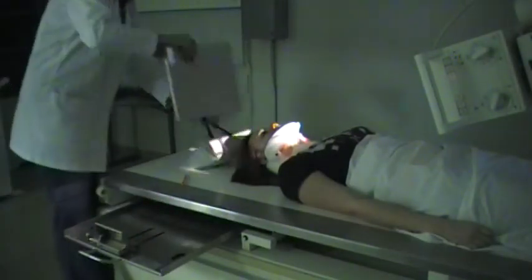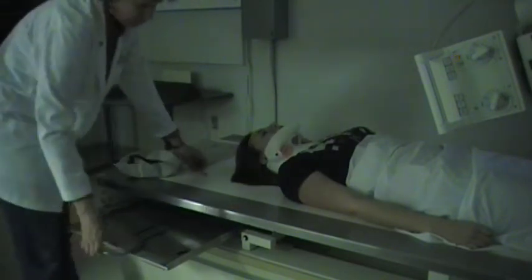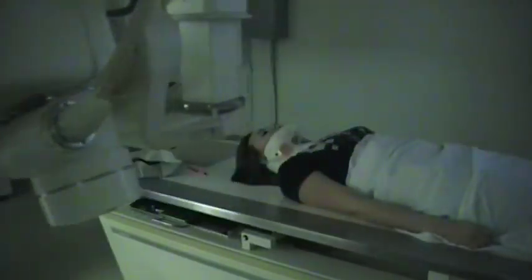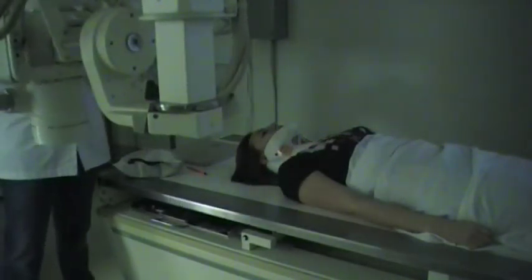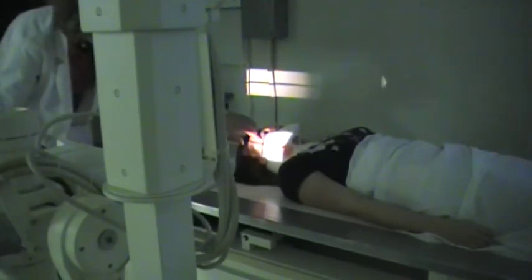Last, I'm going to do a cross-table lateral of the face in the dorsal decubitus position. So I'm going to bring the tube out to her right side. Now for facial bones, our central ray is going to enter between the outer canthus and the EAM. So we're going for that halfway point.